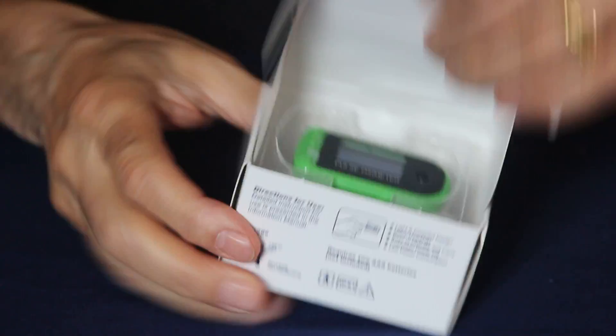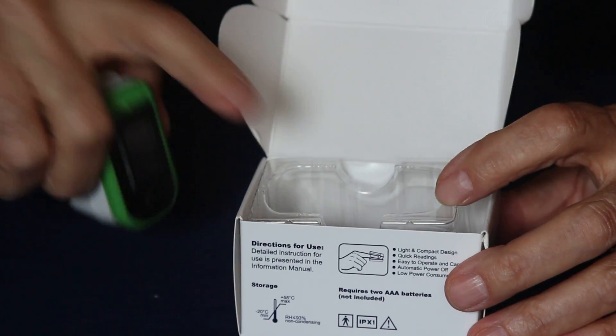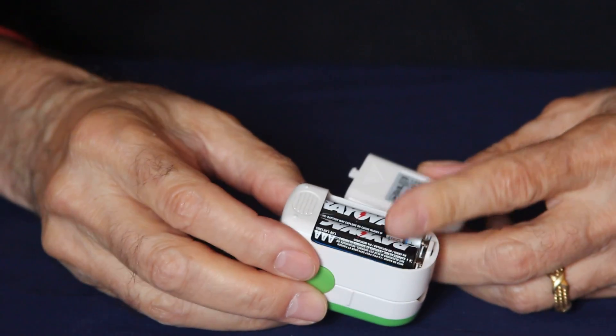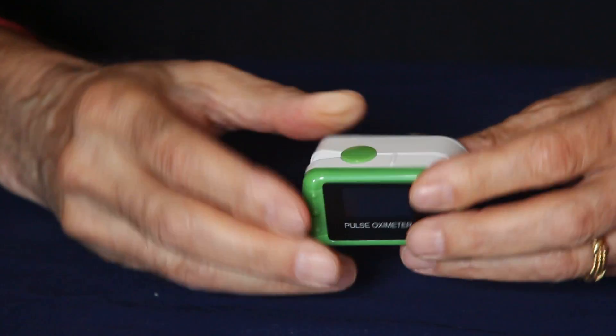When it arrives, it will have the batteries not installed in the unit itself but installed in the box itself. To install the batteries, slide the back door off, observe the polarity of the batteries, install them, and then slide the door back on.